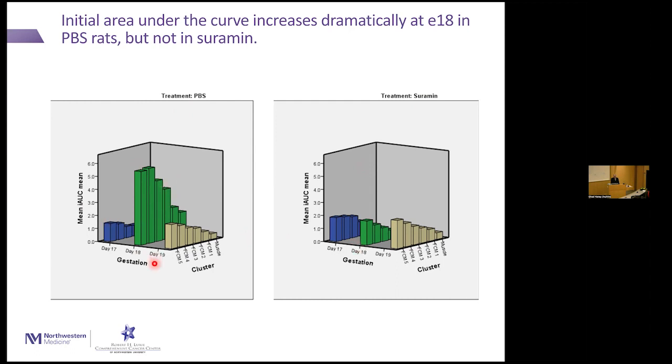And this is just, how can I say, the rat getting ready for delivery. So all this blood is going to the fetus just before the delivery. And that's attenuated in the preeclampsia model. And again, this is without doing any modeling.